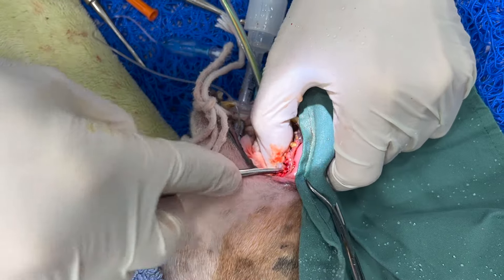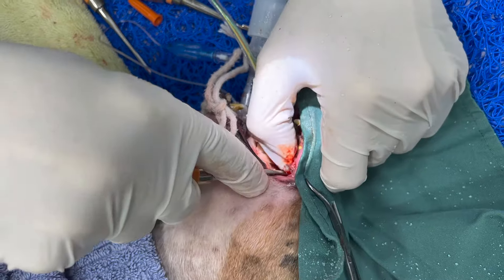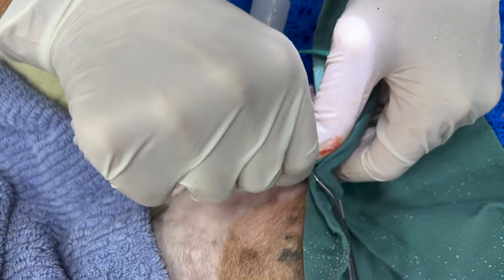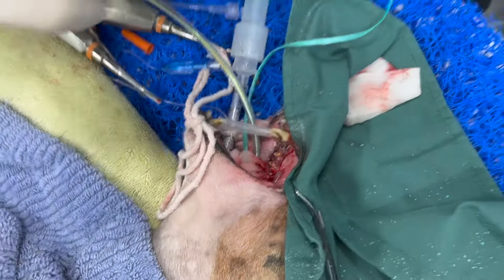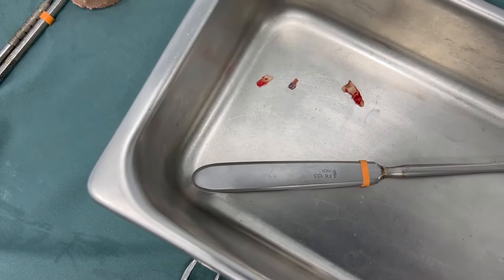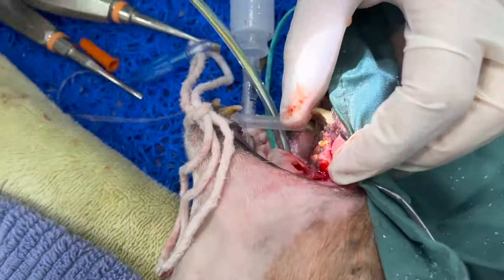I've loosened it so much that I can actually pull it out. I didn't get the complete root, so we're going to go in and find the rest of it — it's a damaged, broken root — but we will get it all out.